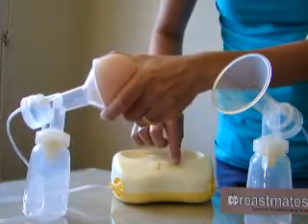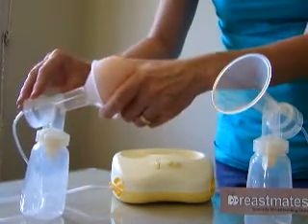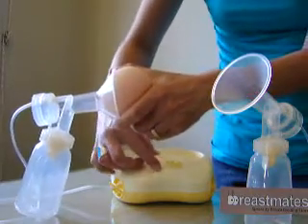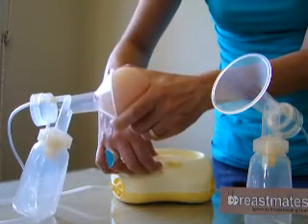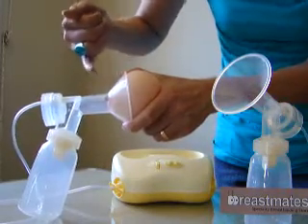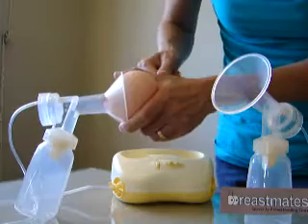Turn it on. You can hear — just using my normal voice — it is quite a loud pump. Then you just turn up the speed to express at whatever speed is comfortable for you. You can see here the nipple is being drawn in and out of the tunnel.